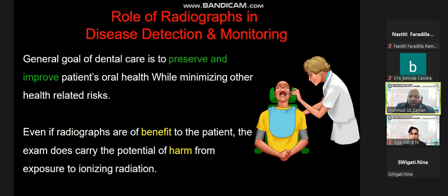Except for MRI, all these dental radiographs use ionizing radiation, from periapical radiographs to panoramic, MDCT, CT, and CBCT. So even if it is beneficial for the patient, there is also a risk from ionizing radiation, and you need to balance risk versus benefit. Which one is necessary, and which one can you avoid by looking at the previous radiograph? You will determine; it depends solely upon you.